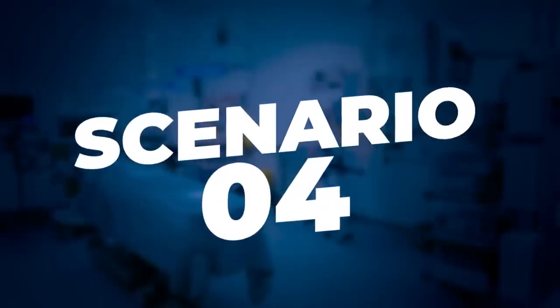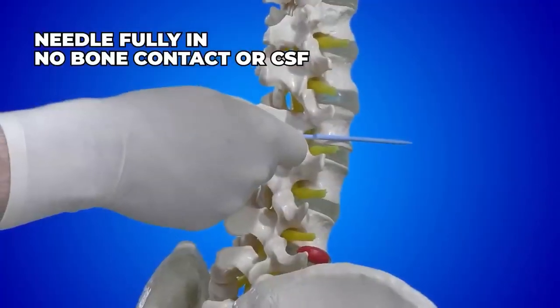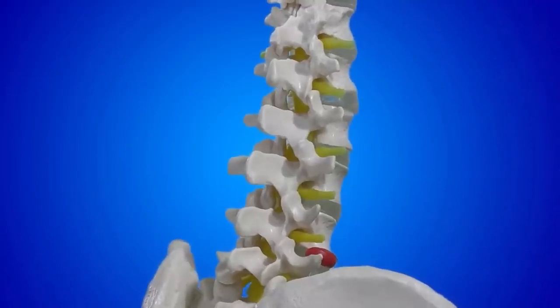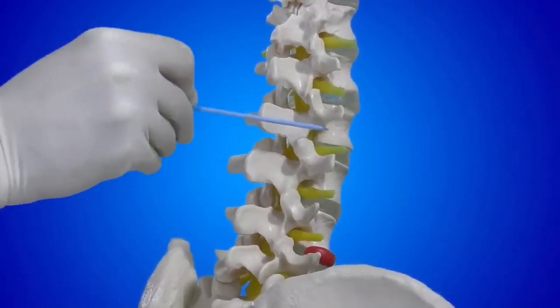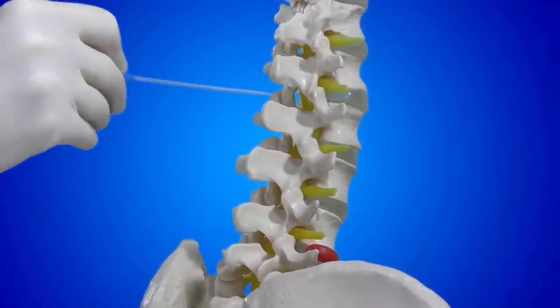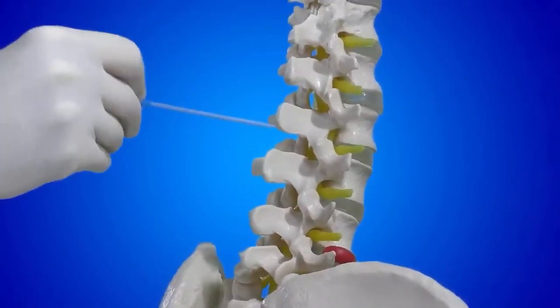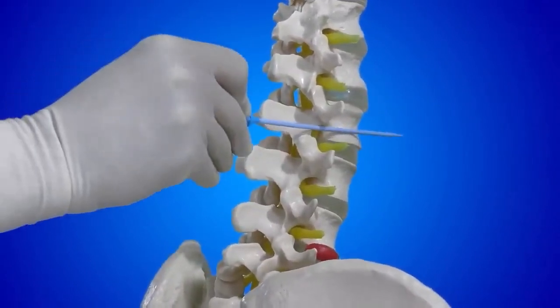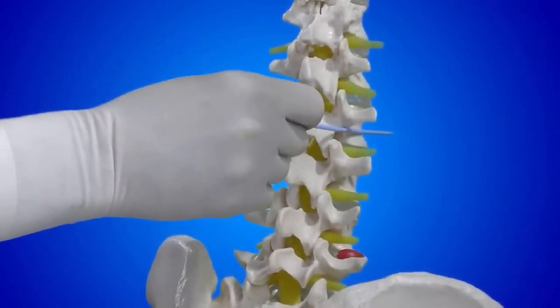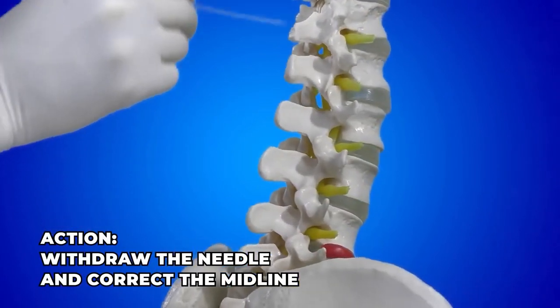Scenario number 4 is where the needle enters all the way to the hub and you do not get any bone contact. In many of these scenarios, the operators tend to think that the needle is too short and they request for a longer needle, whereas in fact they are paramedial without knowing it. They miss the midline and they have inserted the needle into the psoas muscle and they are edging towards the abdominal cavity. The course of action is take the needle out completely and then reassess for the midline.